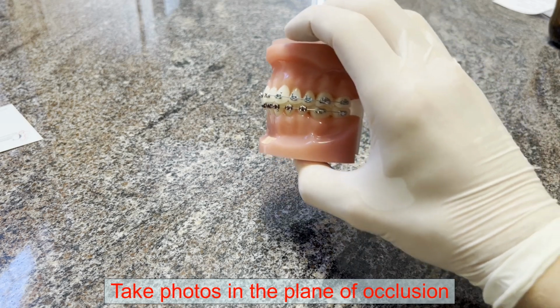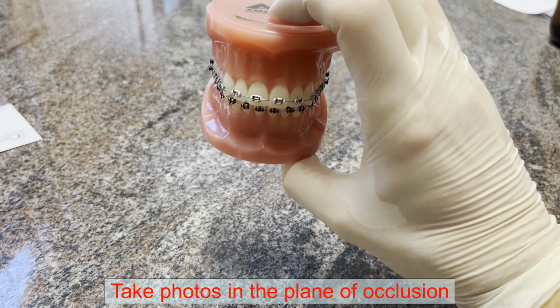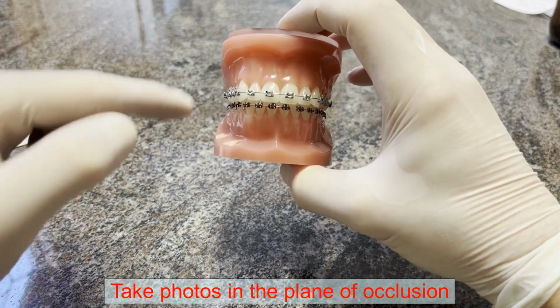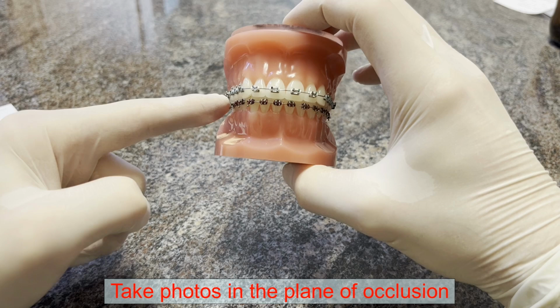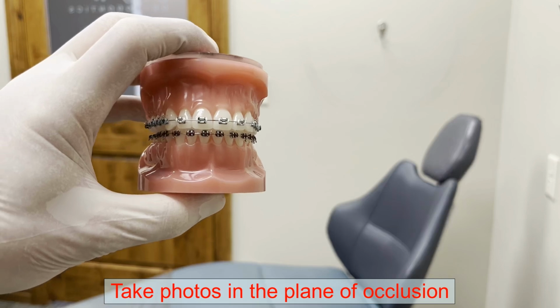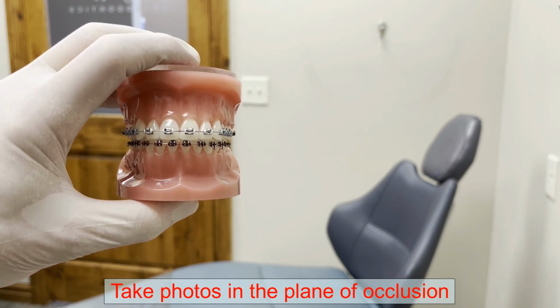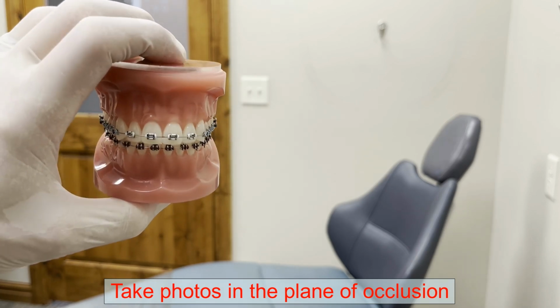Only they won't have a card in their mouth. So it looks like this. From the front, you want it like that. So not taken from above like this, or from underneath like that, but straight on with a flat plane of occlusion. And you know in your viewfinder of your camera, because these back teeth and the front teeth are all on the same plane. They're lined up with one another. So you want all of your intraoral photos to be flat with the plane of occlusion and to be centered left to right, so the patient's looking straight at you and not slightly from the left or the right like this, or not slightly looking up or down.